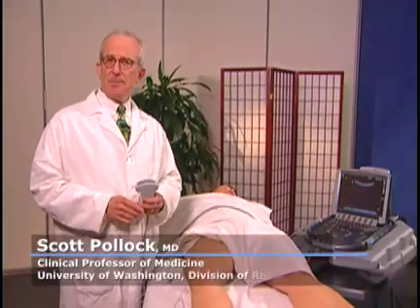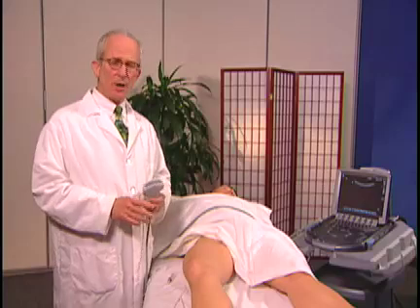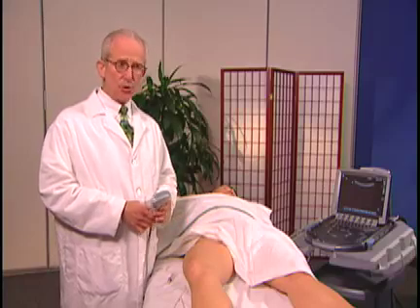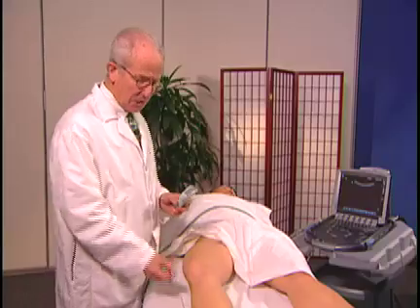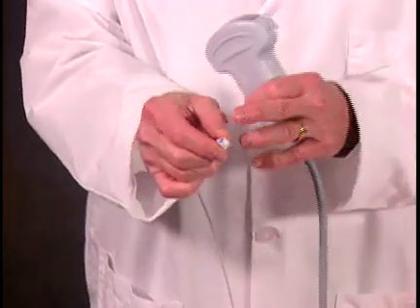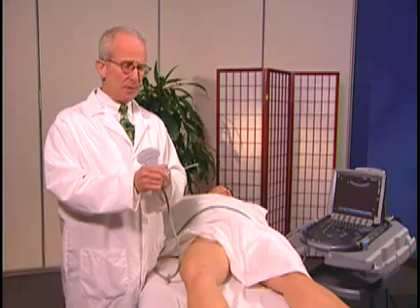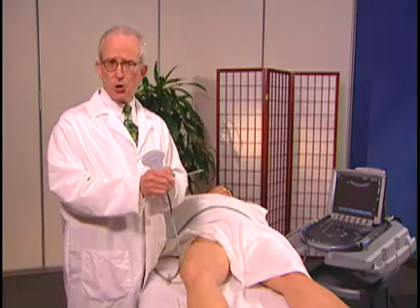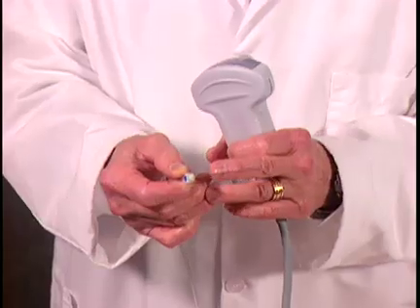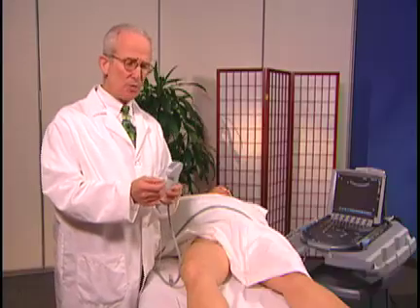I'm going to do a simulated hip injection now and show you how this is approached. I'm not using a sterile technique and I'm not actually going to insert the needle, but I will show you how it's approached. The needle I've selected is an echo block needle — this is a hundred millimeter, approximately four inch needle. You can also use a spinal needle, but in an individual who's large, sometimes you need a special needle like this, which has marks on it that reflect the ultrasound beam and make it much more visible.